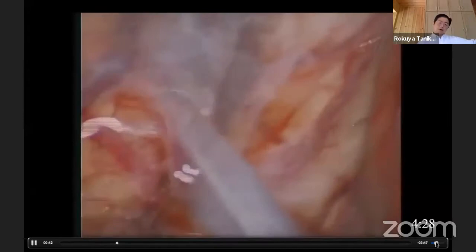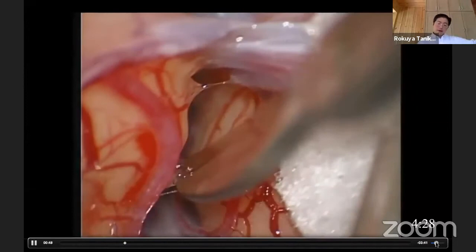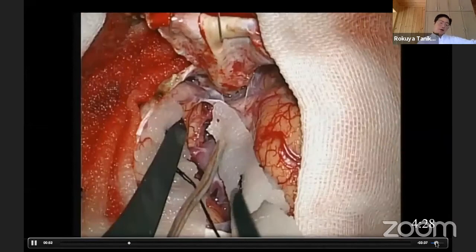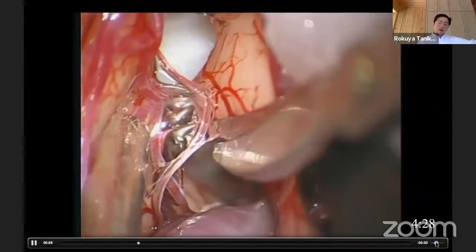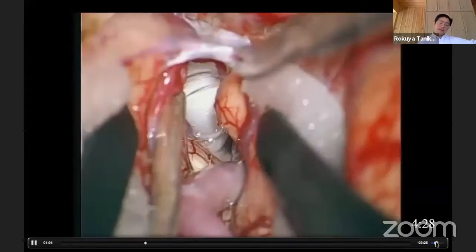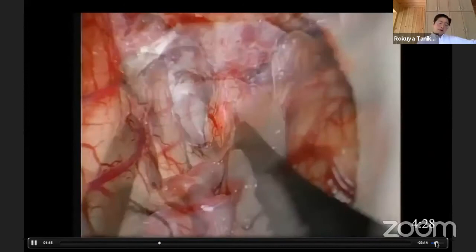With the highest magnification of a microscope, you can see even tiny vessels, veins, and the target structures. Even with non-high-definition standard-definition video, we can clearly confirm the microstructures. The microscope for the neurosurgeon is a very strong weapon because it gives us a very clear, highly magnified vision to understand the micro-anatomy.